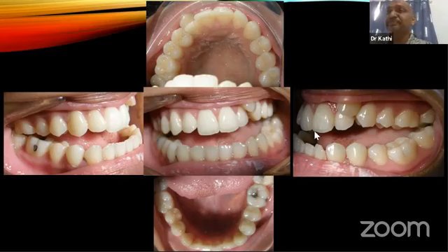Okay, this patient, as you see, has an asymmetrical mandible. Although intraorally it does not look so bad, to correct the centerline and the position of the chin, we needed to do surgery to correct the malocclusion. So surgery was done to correct it. She has a better symmetry now. The chin position is better moved to the center now, so she wouldn't have an asymmetrical chin. So this is immediately after surgery. We use elastics to get upper and lower occlusion together and the centerline corrected.